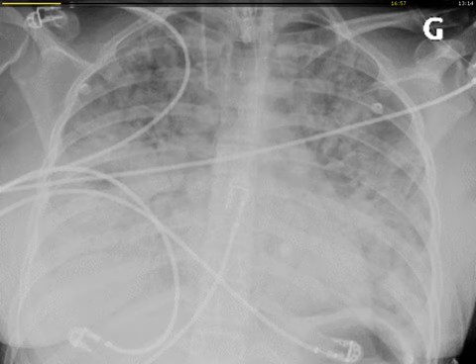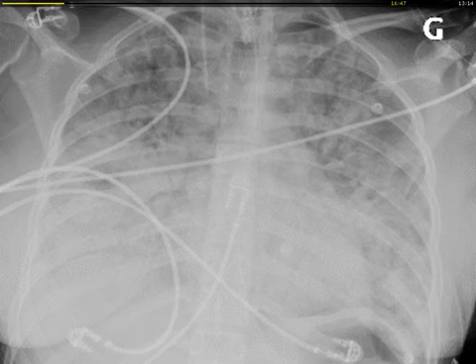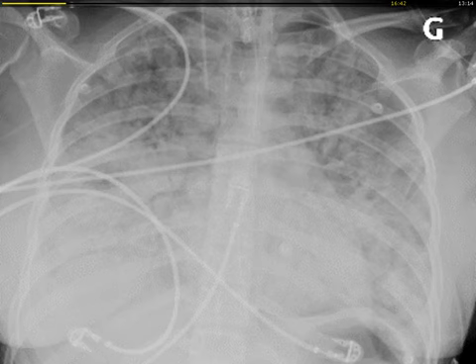So we may select RDS, chronic hypercapnia, brain injury. If we don't select any, it means normal lung. So in this case, I think we should select RDS. Then we have the quick wean function. For the moment, the patient is sedated, so we won't activate quick wean.